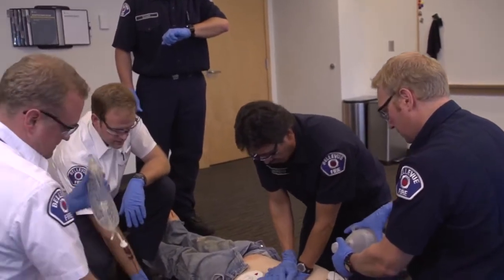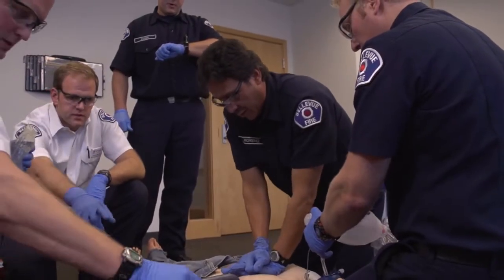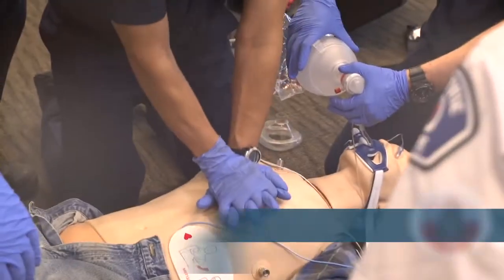There's some lidocaine right there. I'll go ahead and push drugs. We're almost at 45 seconds. 8, 9, 10. 45-second mark. We're still in VF. Let's go ahead and pre-charge. Continue CPR. We're going to pre-charge the machine. 9, 10. Still bagging good. At the shock, Mario, I'll swap out. What's our time? 9, 10.